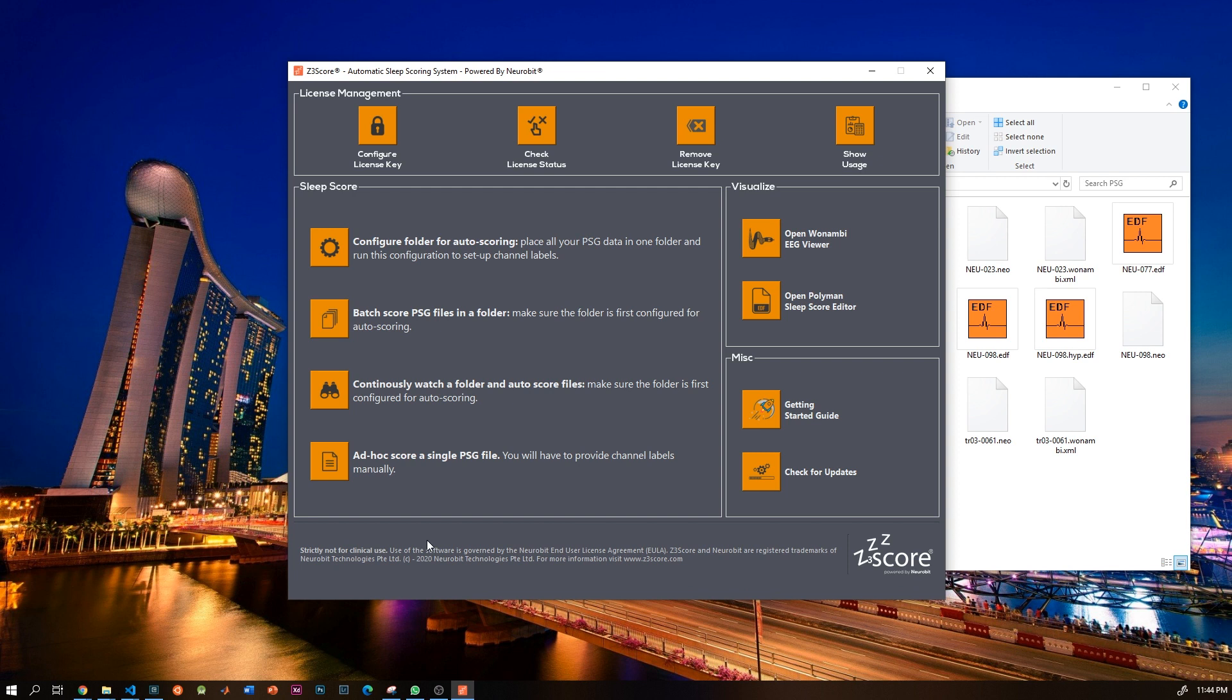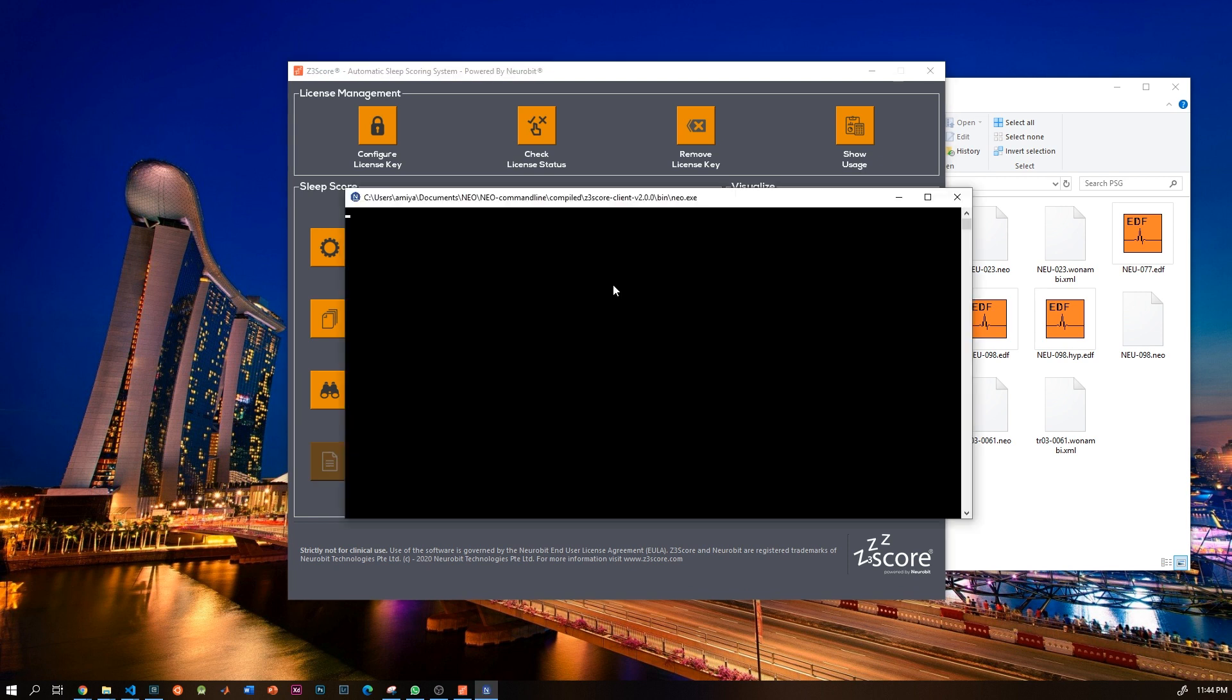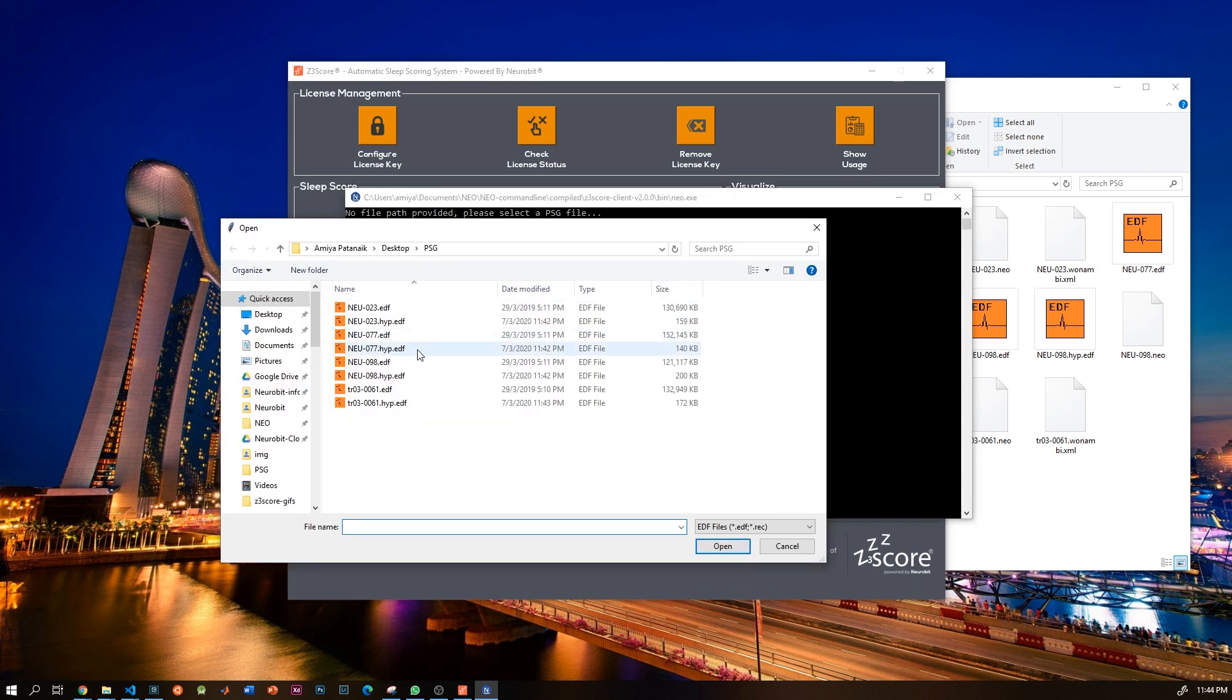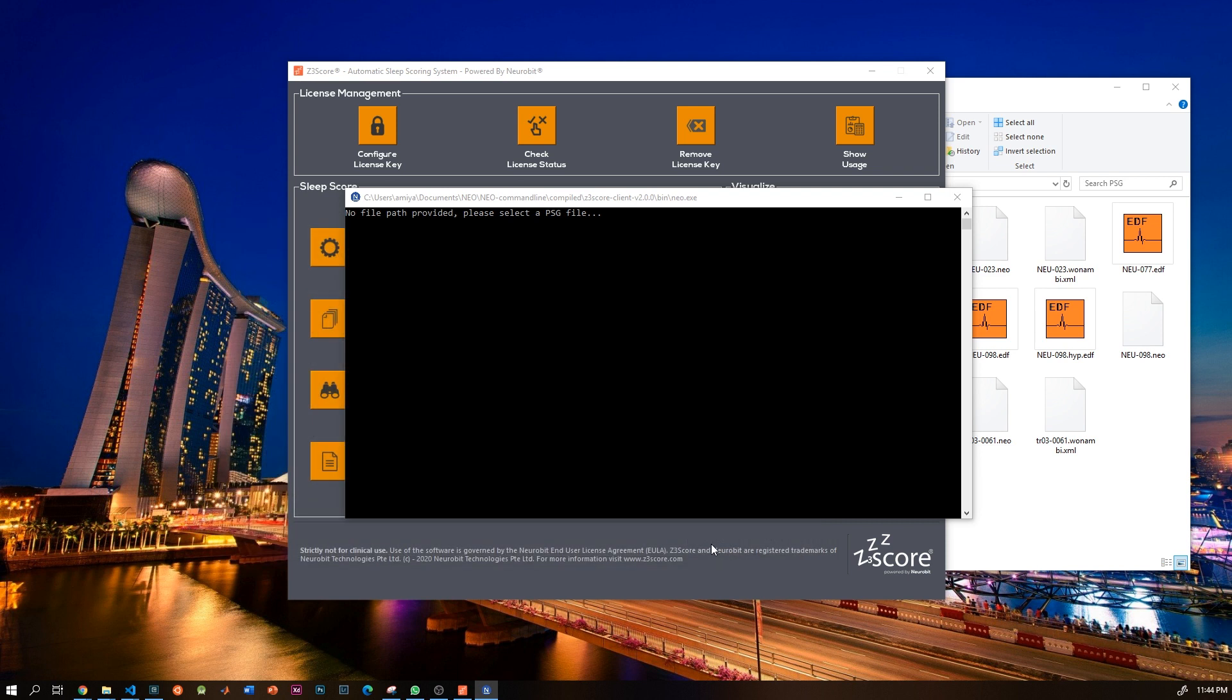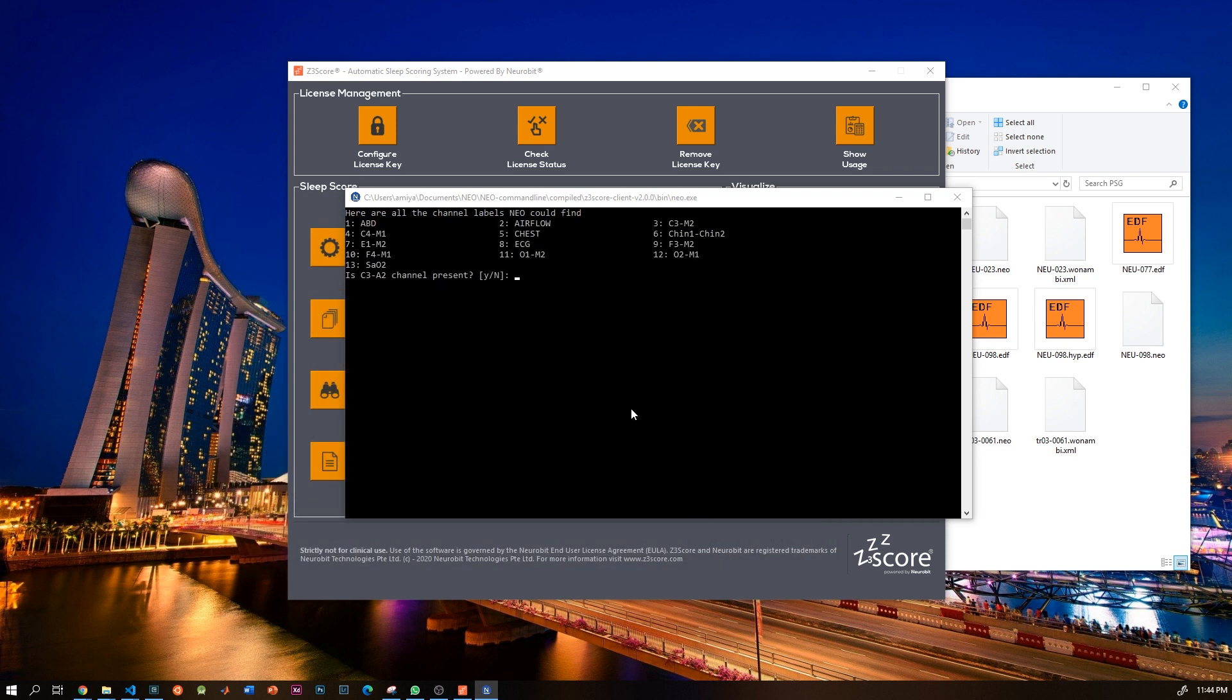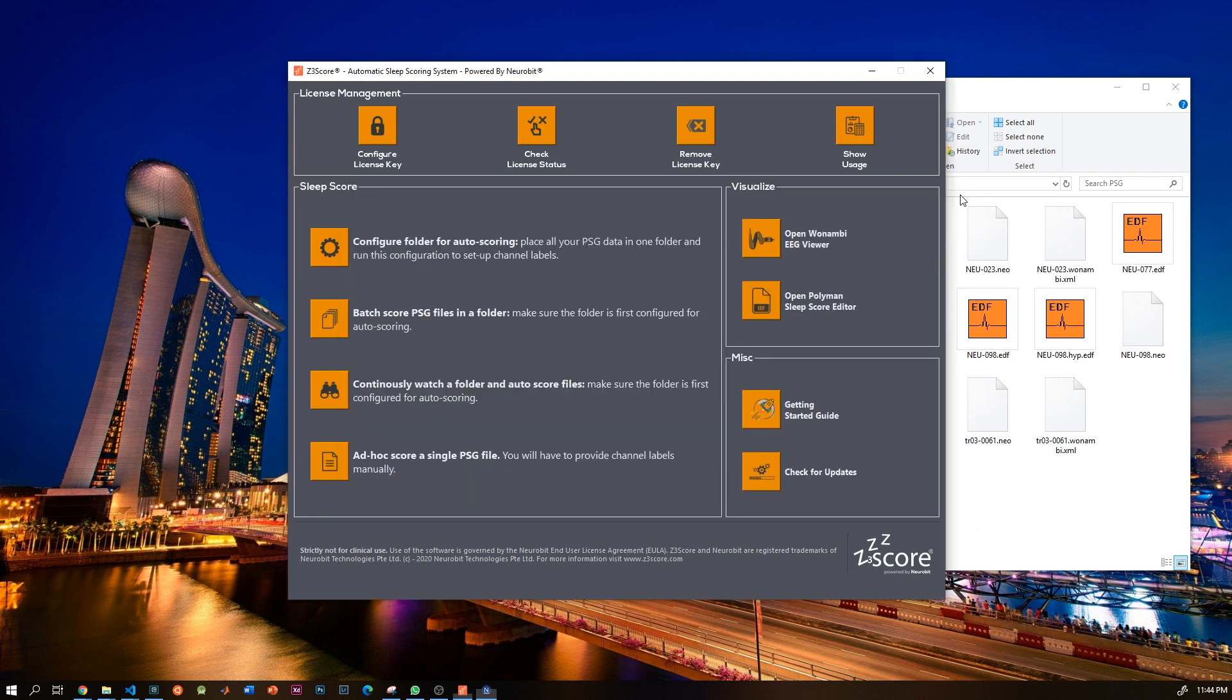Finally, you can use the ad hoc score single file to score one file at a time. If there is a channel configuration present in the same folder as the EDF file, the scoring will be automatic. Otherwise, you will have to manually select the channel labels. Now this could be very handy for ad hoc data that has inconsistent montage or channel labels, or it's maybe missing some of the channels and you do not want to create the configuration folder just for it.